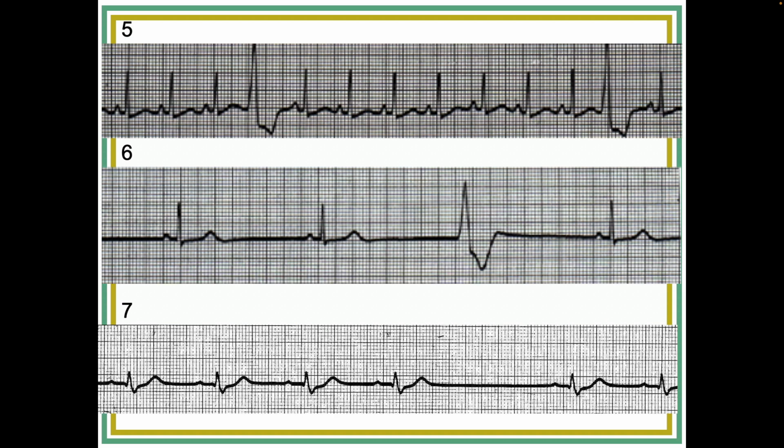Because it's so slow, you may find yourself at some point doing CPR on somebody who has a perfusing rate of 30, because it doesn't sustain long. So in this particular case, if you think of it like that, I'll give it away right now. Again, you don't need to know it, but this happens to be a ventricular beat, a ventricular escape beat. You don't need to know that.